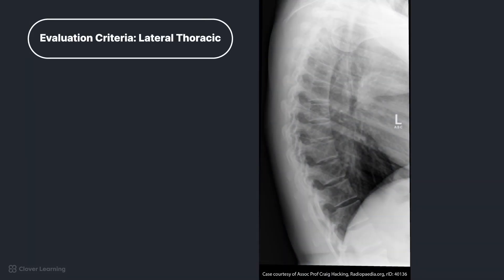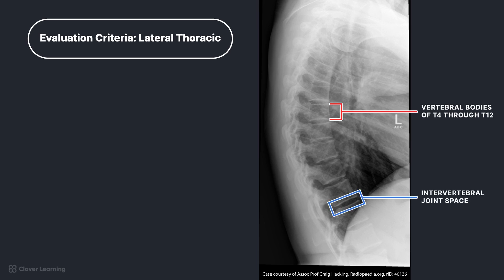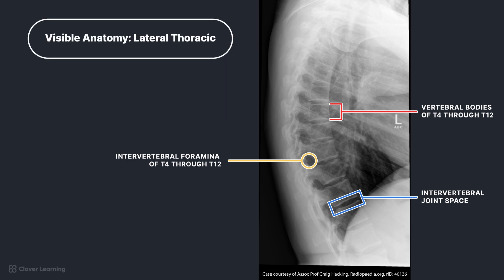Here we have the lateral projection of the thoracic spine. In this image, the vertebral bodies, intervertebral joint spaces, and intervertebral foramina of T4 through T12 should be demonstrated. The intervertebral disc spaces should be open, and a true lateral is indicated by the superimposition of the posterior aspects of the vertebral bodies. Note that T1 through T3 will not be well visualized, so a cervical thoracic swimmer's lateral should be obtained if the upper thoracic vertebrae are of interest.